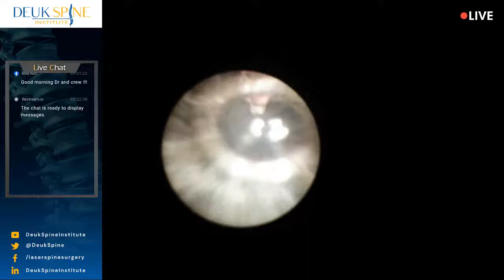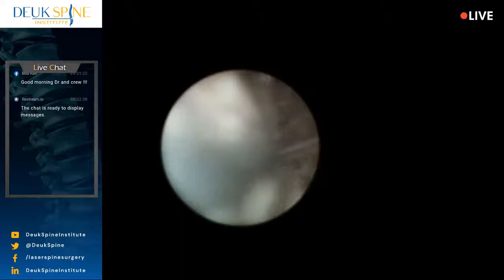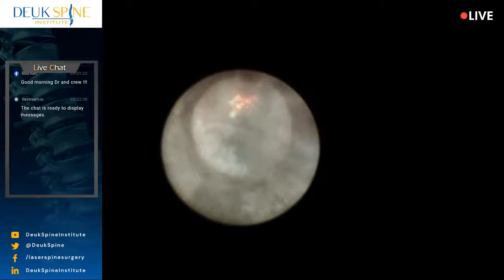Why do I not have good flow? Did you find the pumps yet, Luis? I searched yesterday. I have a couple. You have to get them in now. They're arthroscopic pumps. Yes. Just getting a lot of bubbles. I don't know why. Just could be bubbles in the line. I don't know.